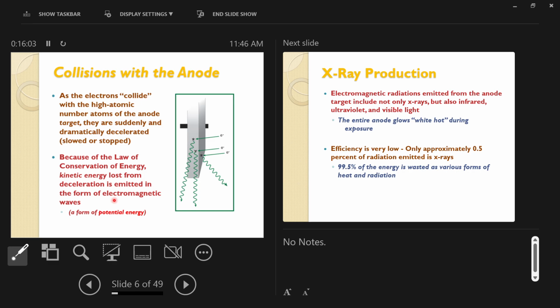You would also feel some heat from the exposure, and some of it would be the X-rays that you cannot see or feel, okay? You're sensitive to electromagnetic waves, just not all of them, right? You cannot see or feel radio waves, but you can feel thermal waves, right? You can feel infrared, it's heat, okay? You can't feel visible light, but you can see it, okay? And you can neither feel nor see X-rays, okay?